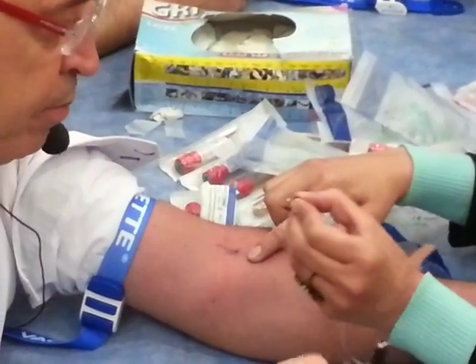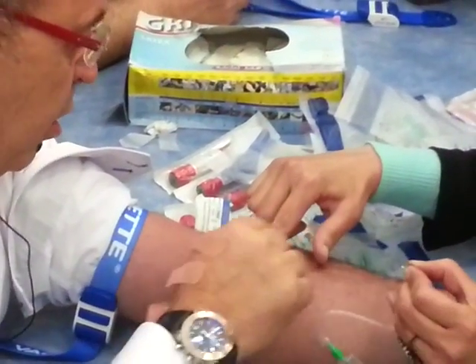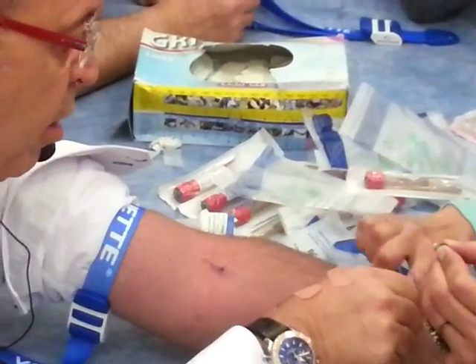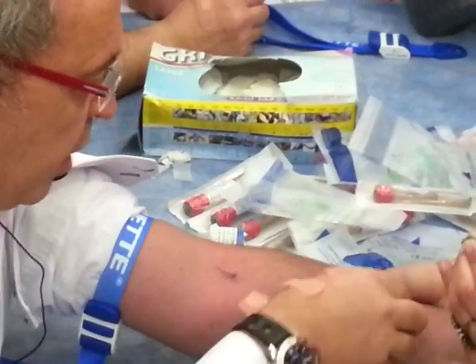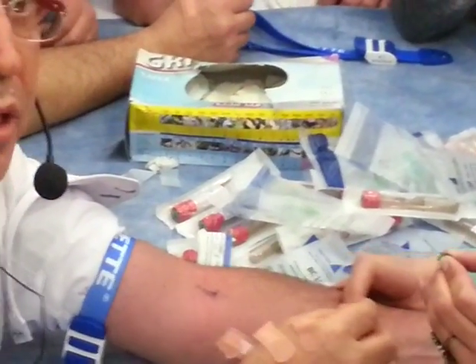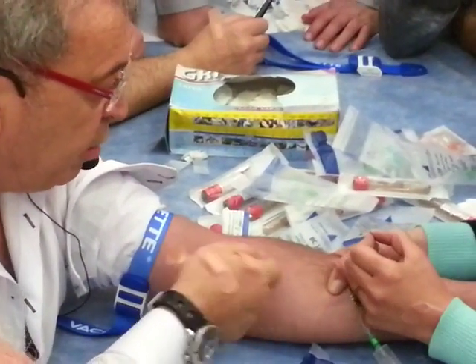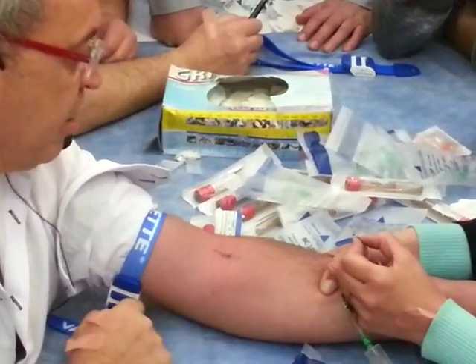Take that. If you put your finger here, you cannot. Take my arm, like that, and then pull this. You see? You have to be far from here, because if you put your finger here, you cannot. Let's go.